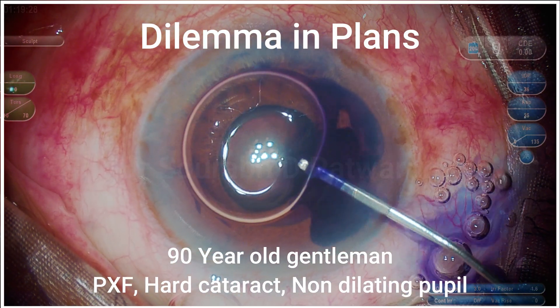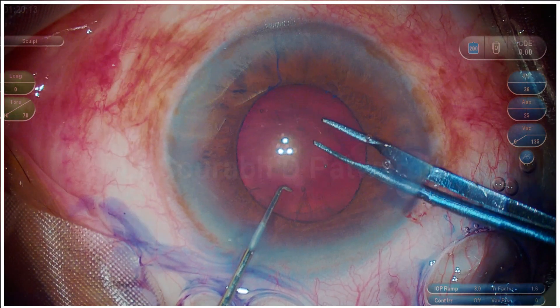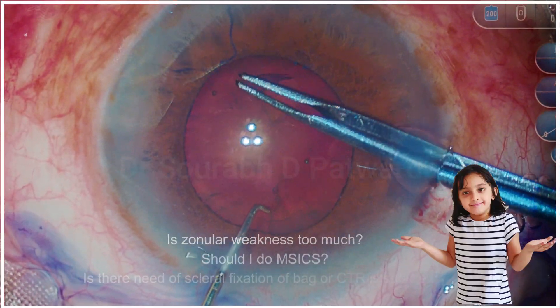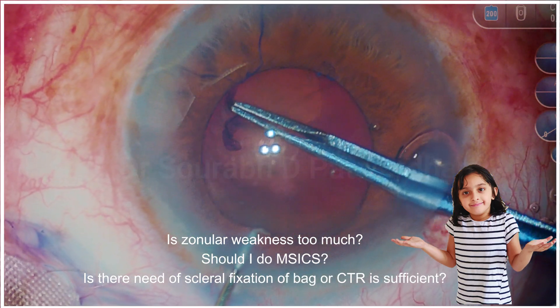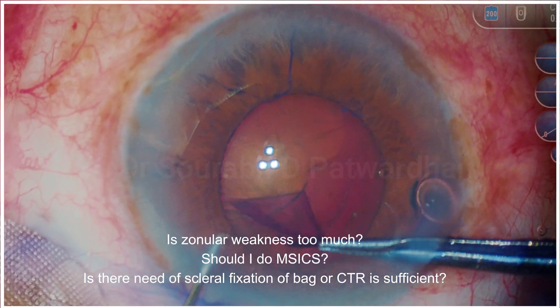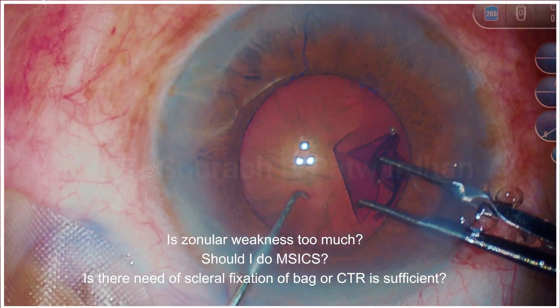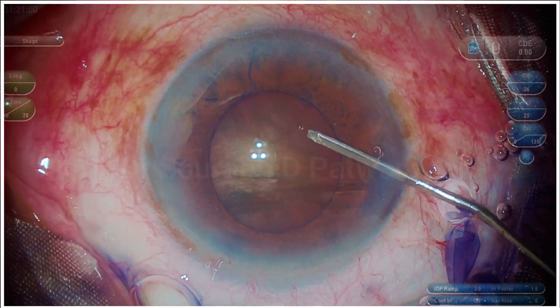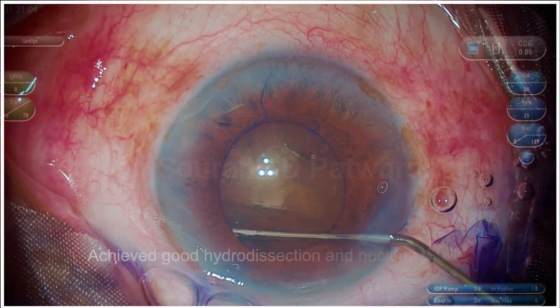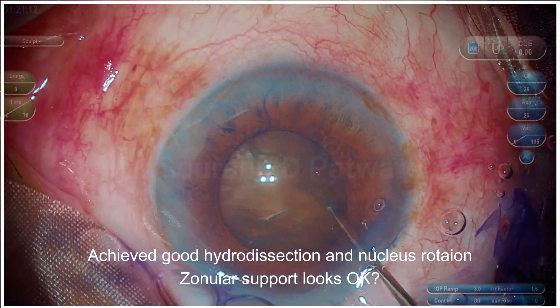This is a case where we have a dilemma in the planning. A 90-year-old gentleman with pseudoexfoliation, hard cataract, and you can see here that the zonules appear weak. The question is: is it too weak? Should I go for a manual small incision cataract extraction? Do I need to fix this bag to the sclera, or is just a CTR enough? These are the usual dilemmas we have in dealing with such cases.